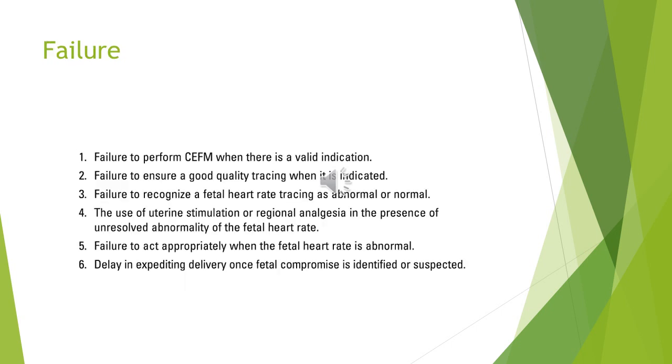But unfortunately, CTG is not the magic stick. Doing a CTG doesn't mean that you are protecting the baby. Unfortunately, there are a lot of failures, either because you fail to perform CTG when there's a valid indication, or you fail to ensure good quality tracing. And for good quality tracing, there are certain prerequisites which we'll discuss. If you don't follow these good quality measures, you can actually lead to complications.